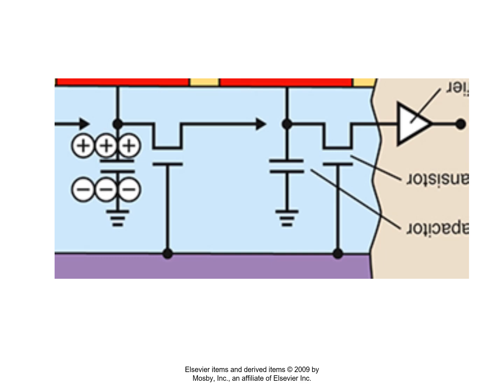Okay. Now if we turn off the gate electrodes, now those positive charges want to drift to the next available storage capacitor, which is the one in the next pixel over. Okay, the one that's indicated there with half of the word capacitor. Okay, and so again the process repeats itself.